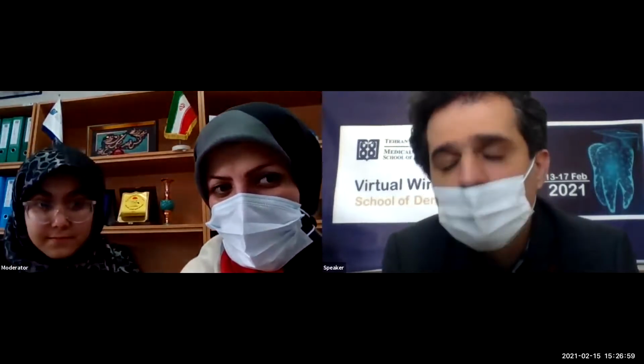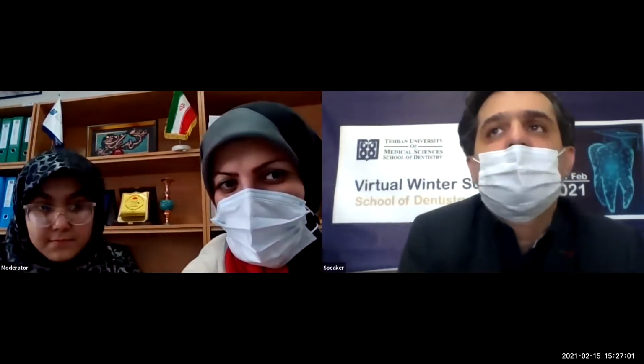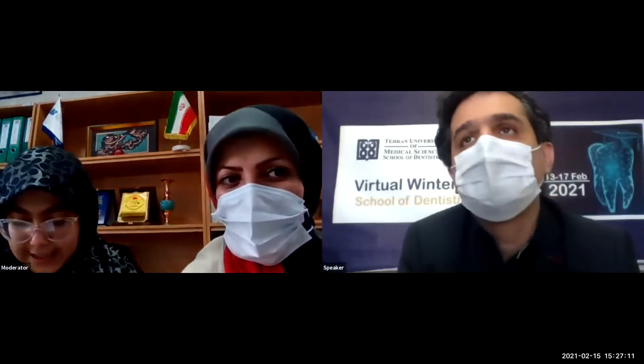How many rotations per minute do you use for shaping and polishing? Less than 10,000 RPM, rotations per minute. Less than 10,000. And we should use water for the polishing system.